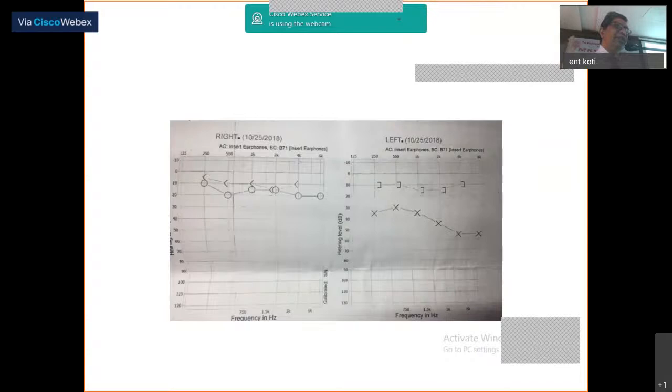First, usually they select a sound of 1000 Hz. Then the patient is made to learn the sound by delivering it at a higher level where he can perceive it. Then we bring it down alternately. Then at one stage he cannot hear. Then again 5 decibels more is given. Then he can hear. Then it is brought down again. Then he says I cannot hear. That is how the threshold is recorded. Got it? Then they do the same for all the various frequencies: 250, 500, 1000, 2000 and so on.